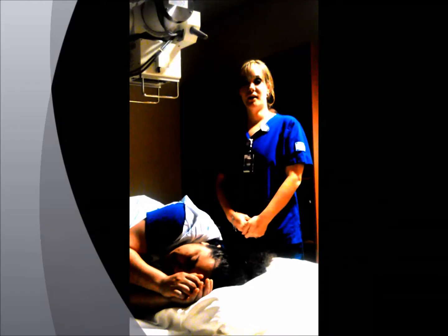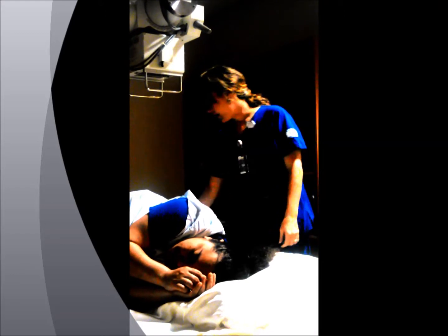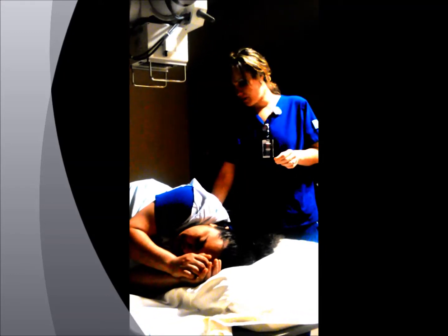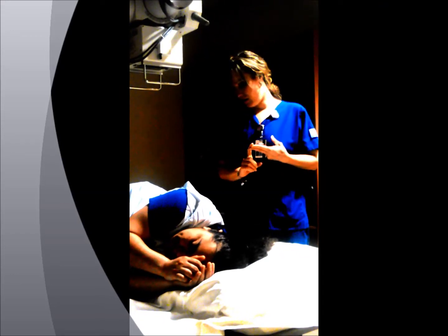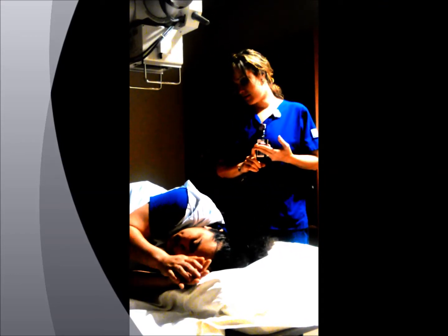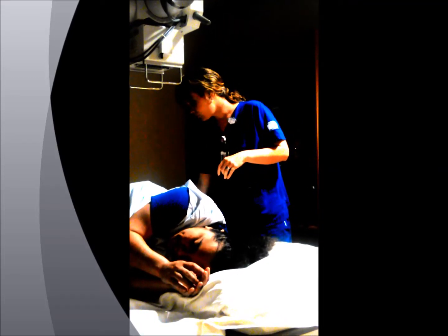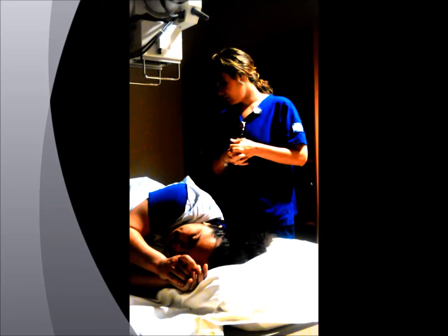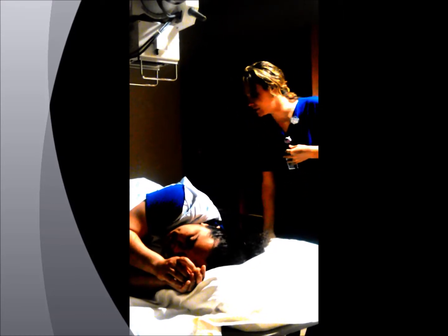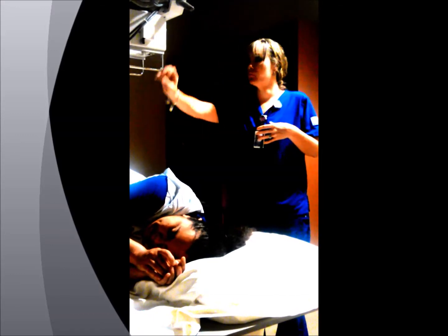I will be demonstrating how to position for the left lateral lumbar spine. And for this particular position, the pathology demonstrated is fractures, spondylolisthesis, neoplastic processes, and osteoporosis of the lumbar vertebrae. And for this particular one, you're going to have about 85 to 95 kV range. And you will be using the large IR, the 14 by 17, and you put it in lengthwise. And make sure you are lined up with your bucky.